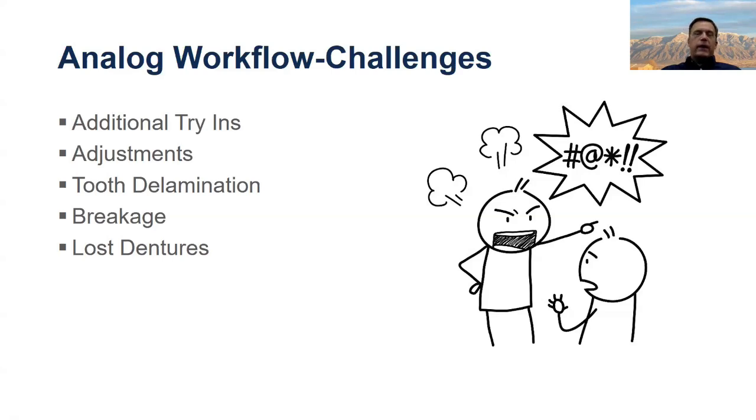Breakage can occur because we follow generally accepted procedures to make sure our base plate is thick enough, but you can't always tell how thick it is.